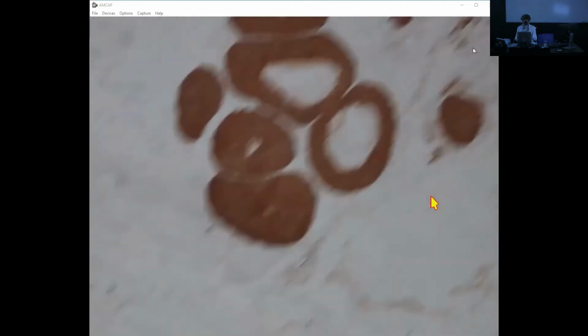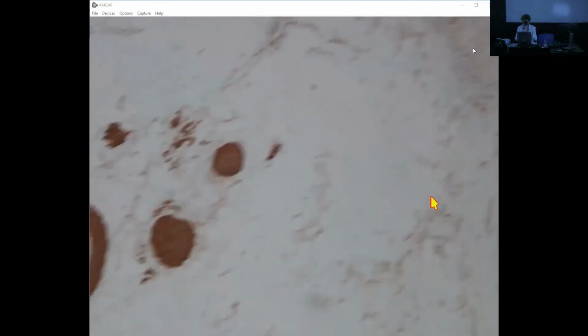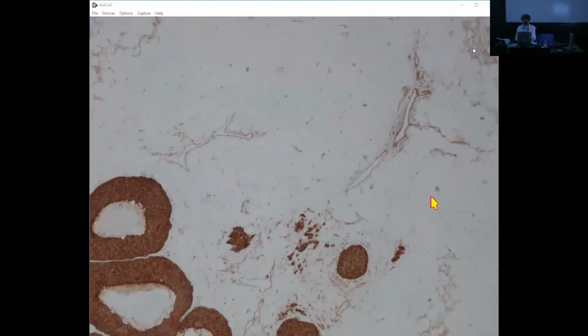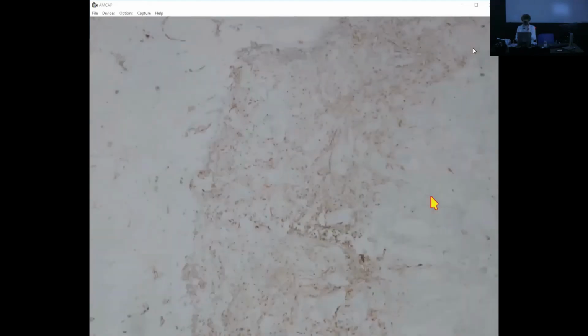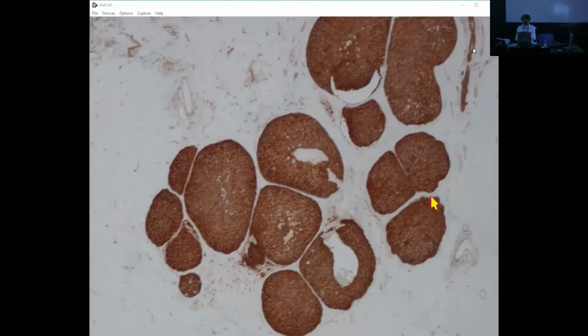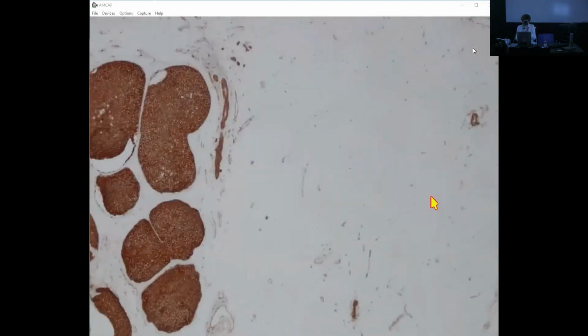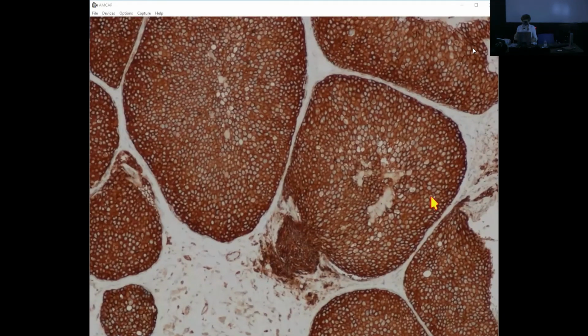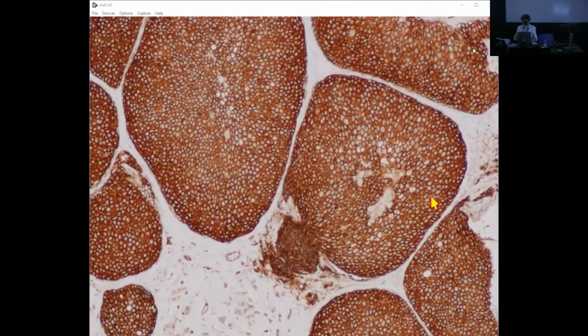Let's see that focus where there was cell polarity, if it's still there, I don't know. It's an interesting dilemma. The invasive is also staining the same way. It's mostly ductal. So there is always this question, do you use E-cadherin or P120 to diagnose the morphology of the invasive carcinoma? It's of no practical utility to know. I would have diagnosed this as invasive lobular in that previous H&E slide. That's what it looks like.